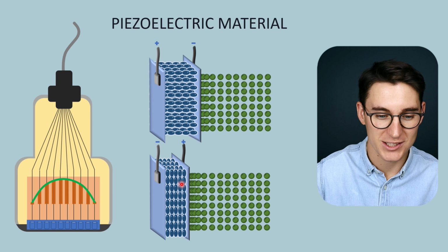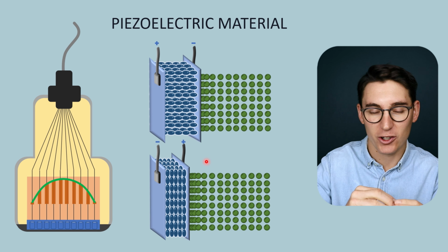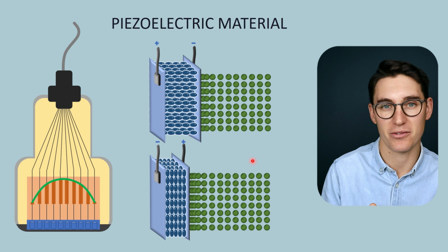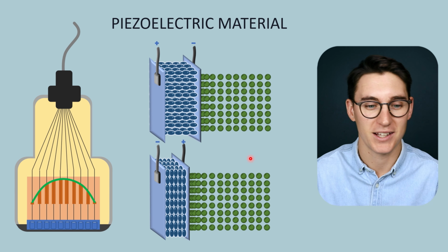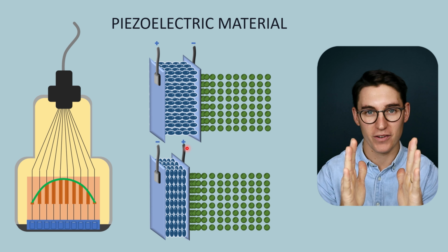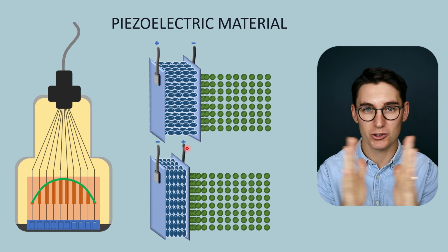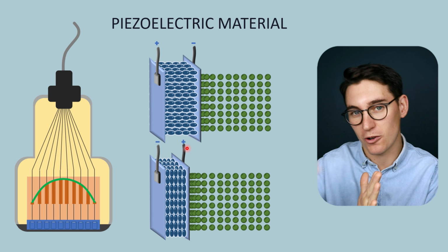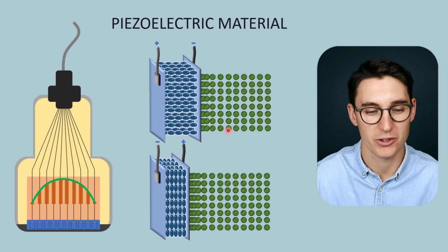So this compression you can see here changes the orientation or the shape of that PZT material and causes an electronic signal to be induced. This is what's known as the piezoelectric effect. Now the reverse is also true, and it's called the reverse piezoelectric effect. If we were to alternate currents on these electrodes on either side of our PZT material, that alternating current will cause the PZT material to change shape like this. That change in shape will cause regions of compression and rarefaction within the units that abut that PZT material.